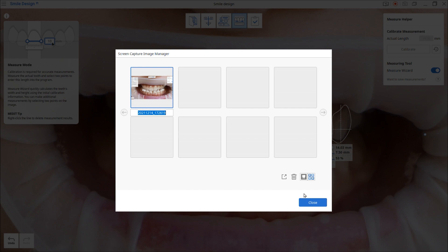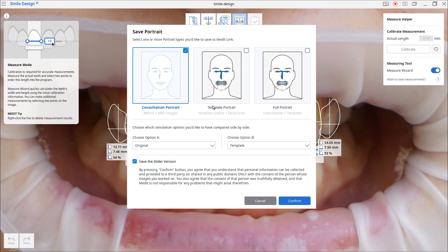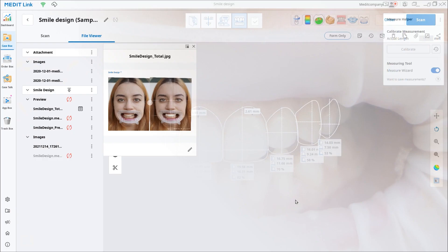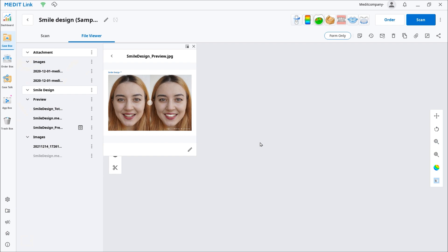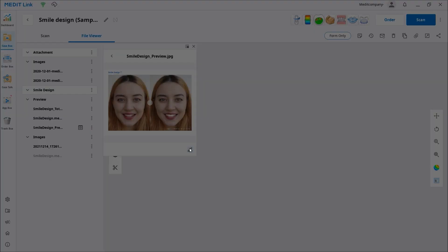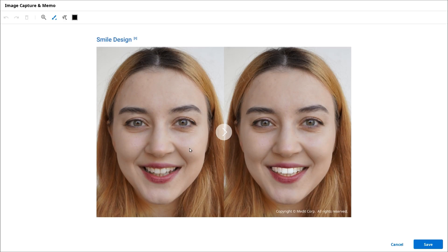When you are finished, click Complete. Choose the portrait you'd like to save, then click Confirm. The saved portrait and project file will be saved to Medit Link.